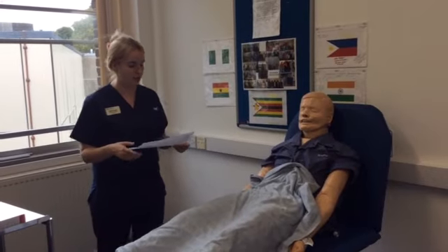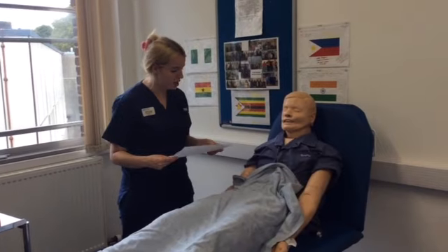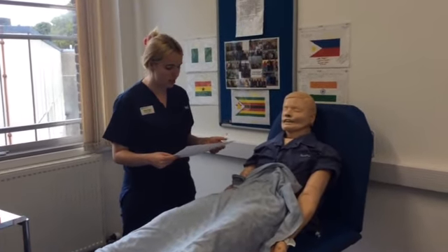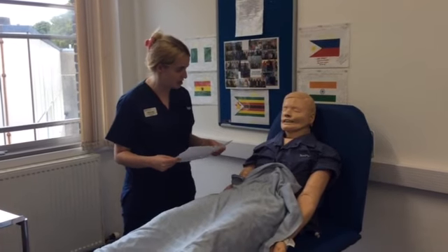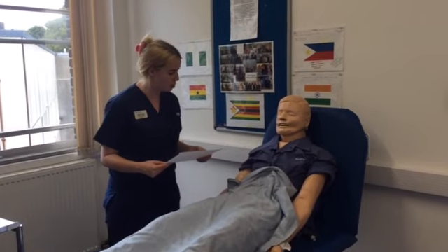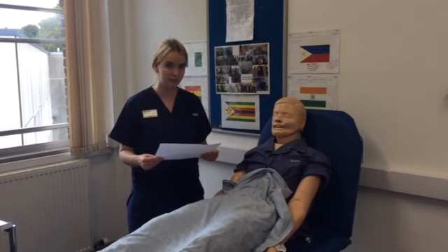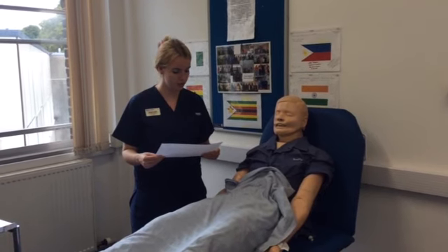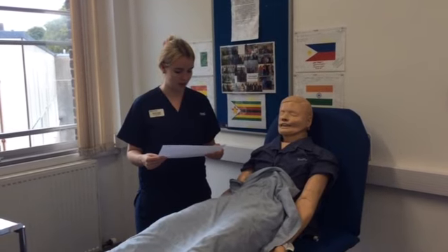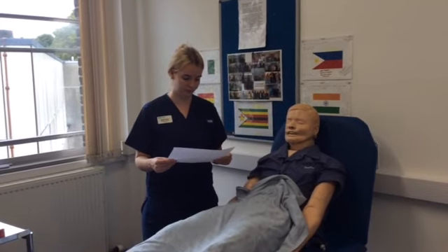Assuming I've already met the patient and introduced myself. Hello James. Hello. I've come to help you with your inhaler today. Okay, thank you. I'm one of the nurses here working at the GP's practice. My name's Beth. Is it alright if I just check your details before we proceed? Yes, that's fine. Okay, can I have your full name? Yes, it's James George. Your address? 12 High Street, Poole, BH12 4PH. And your date of birth? It's the 6th of the 6th, 2000.